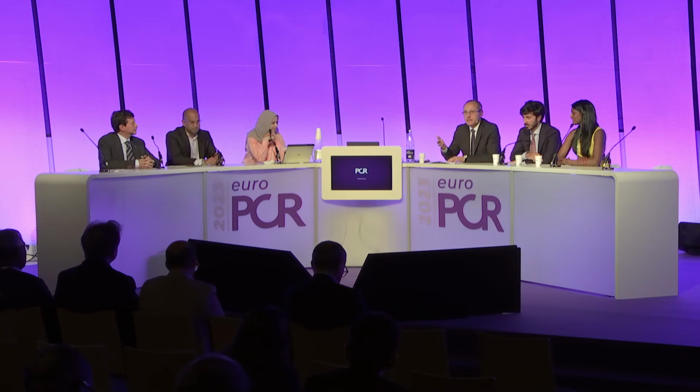In the interest of, let's say, completion of information, this is an edited case, and I can assure you that the colleagues in Toulouse did IVUS pullback at each and every step of their procedure. So even if you haven't seen that on the screen, they were performed, but I had to squeeze a 2.5 hour case into a 20 minutes case. So just to be completely transparent.